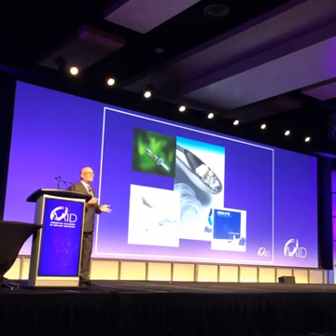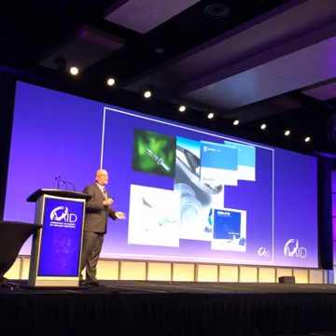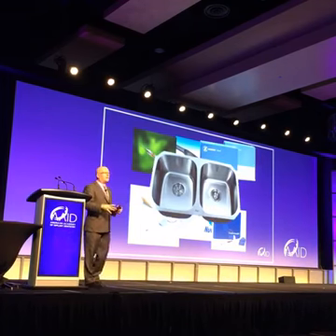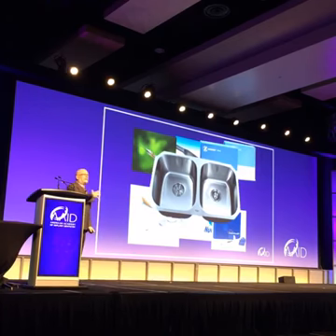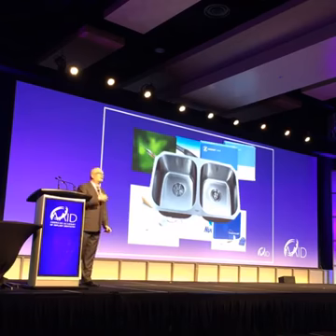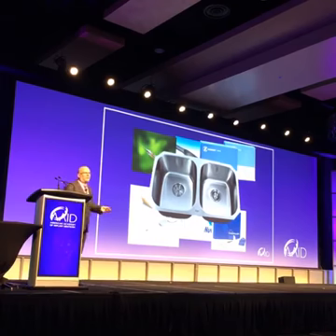Are you going to use a BMP? Are you going to use a resorbable membrane versus a non-resorbable membrane? Or what I call the kitchen sink approach is just throw everything in there and hope something sticks. But again, if you add everything in there, how much is it going to cost you and how much is it going to cost the patient? There's a cost involved. And the patient goes, well, it's going to cost me $3,000, $4,000 to fix 3 millimeters of bone around a $4,000 implant. I don't know if that's good for me, doc. Why can't I just cut away the tissue and I'll worry about it later? Or take the implant out and start again.